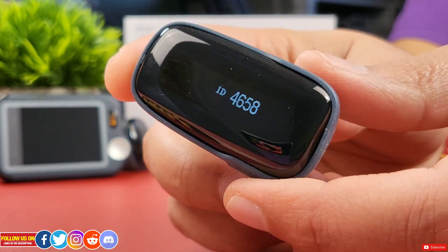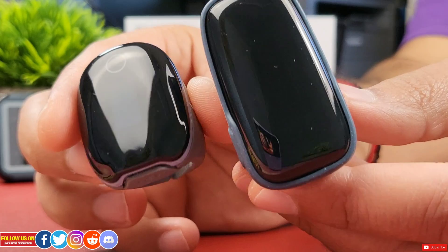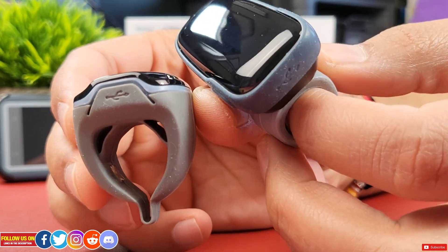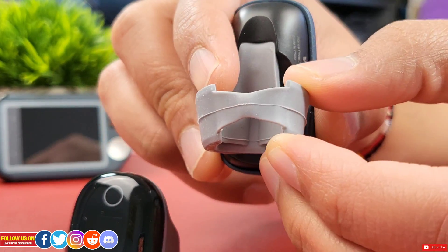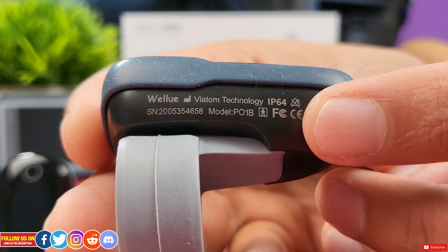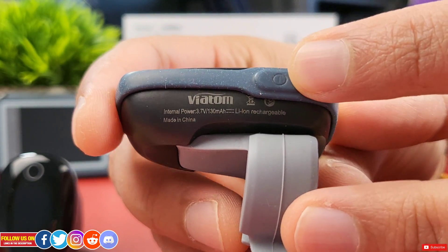The OxaLink has the same ring sensor design as the O2 Ring. I personally find the OxaLink ring sensor is a bit too narrow compared to the O2 Ring for my fingers — the thumb fits great, but if you have large or swollen fingers it will fit, though I'd be concerned about the longevity of the rubber holding the ring in place.